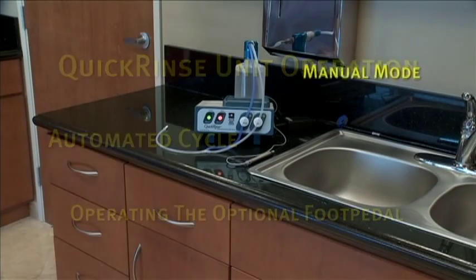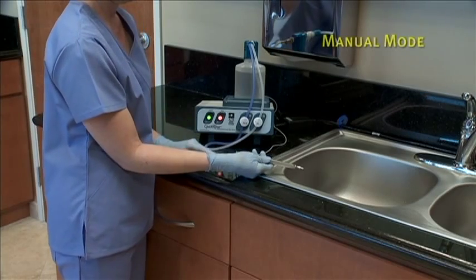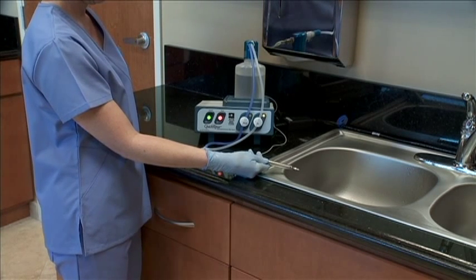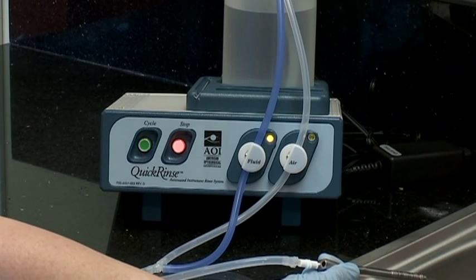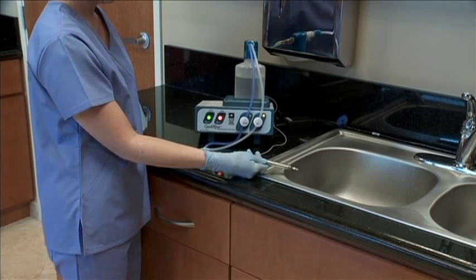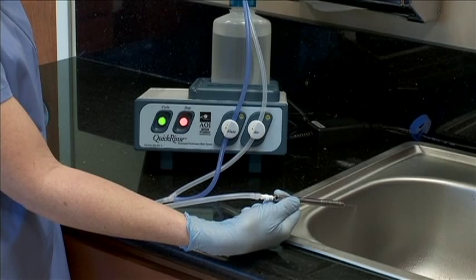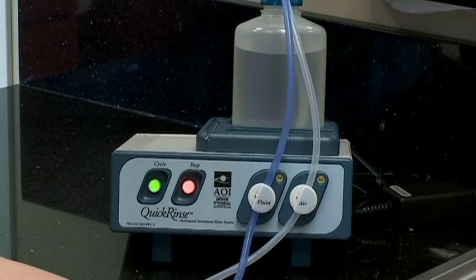To begin the manual mode, first connect the instrument interface tube to the item to be rinsed. Make sure tubing is securely gripping the item to be rinsed. To enter manual mode, first press the cycle button once to begin the automatic rinse cycle. At any time during the automatic cycle, press the cycle button a second time to enter the manual mode. You will notice that the cycle button will begin to flash when entered into manual mode. While in manual mode, the user can alternate between fluid and air by pressing the cycle button. The amber light above the open valve will illuminate. To end the manual mode, press the stop button. The cycle button will stop flashing and the unit will reset for the next use. If no buttons are pressed during the manual mode, it will time out after one minute.